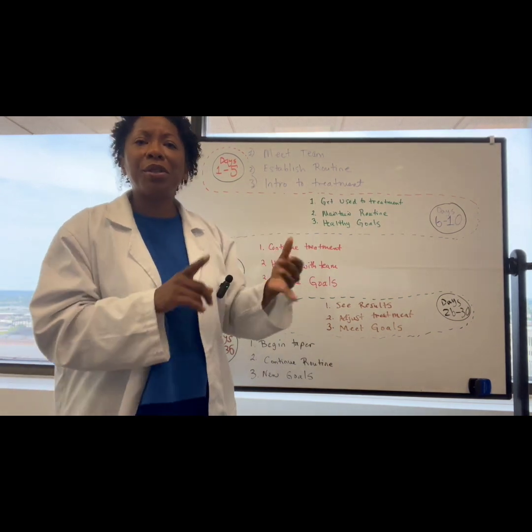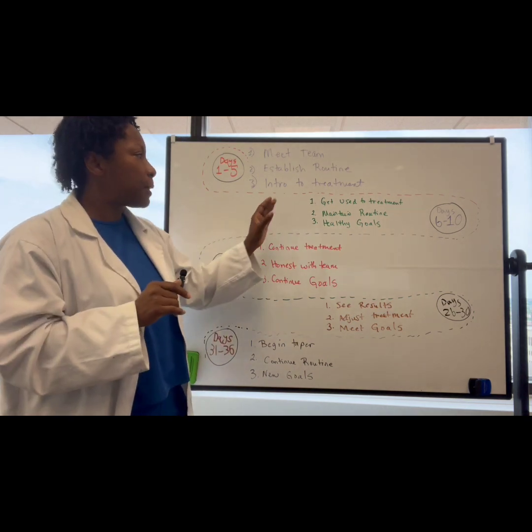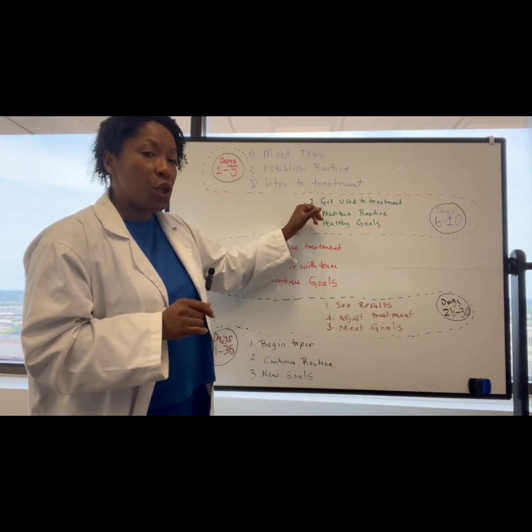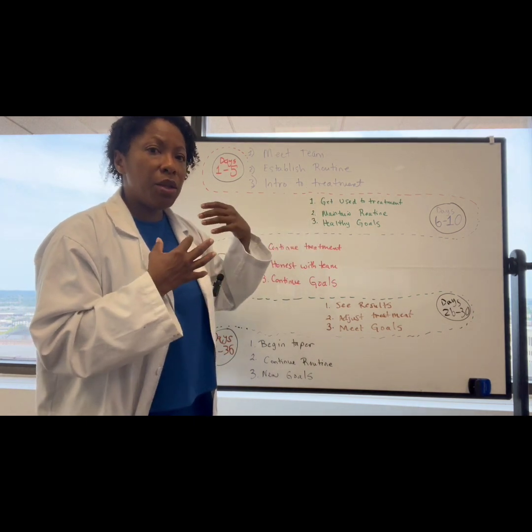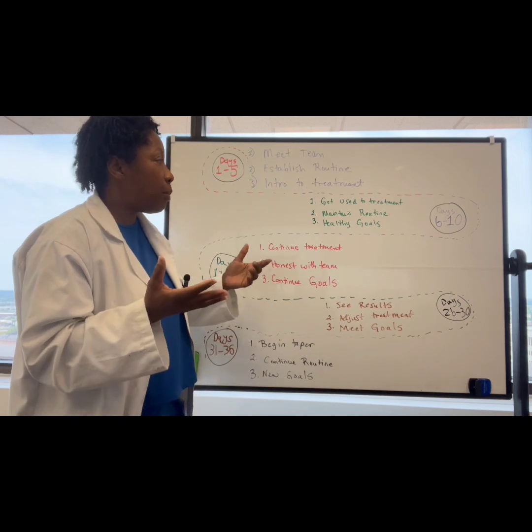If you're having difficulties with pain or any symptoms at all, headache, any of those things, you need to let your treatment team know. Because you're getting used to the treatment, but that doesn't mean that you have to be in pain. There are things that your treatment team should be able to do to help you out.